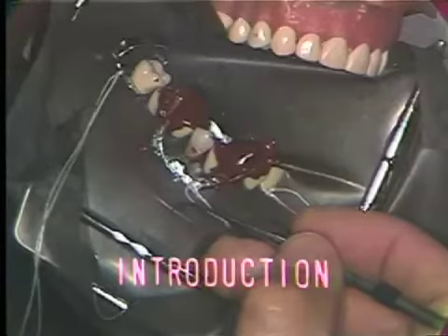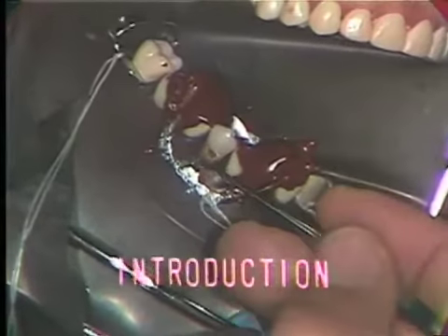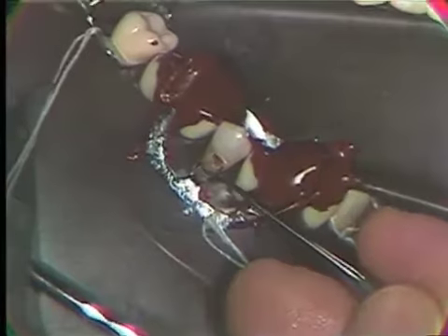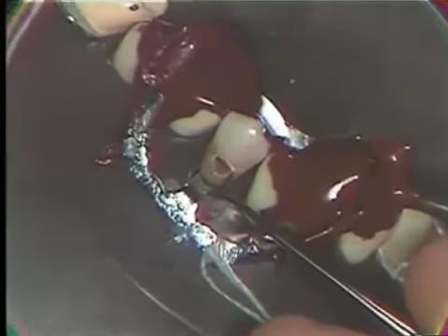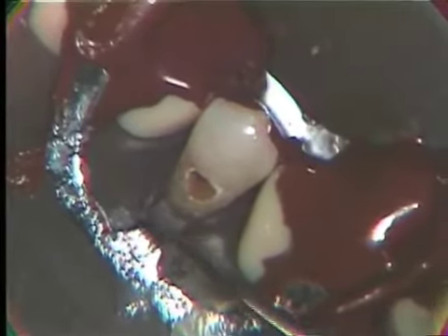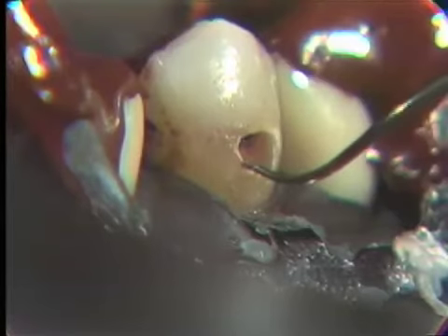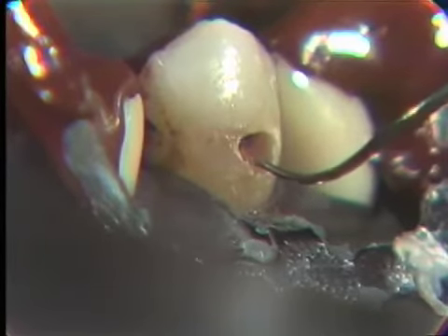This Class 5 cervical lesion has been treatment planned for an amalgam restoration. There is a cavitation and a loss of enamel and a penetration of decay down into the dentin. You will note the extension of the carious lesion laterally with a decalcification, a white chalky appearance, and staining that undermines the enamel of the buccal surface of this mandibular first bicuspid.